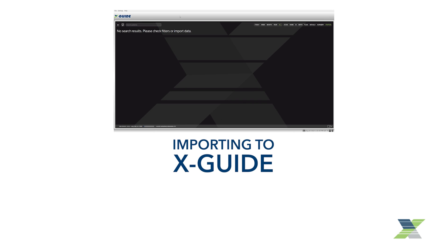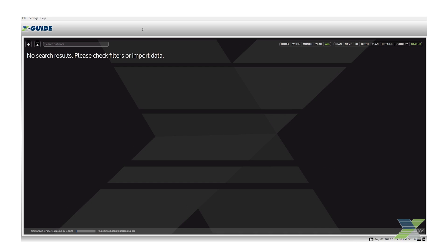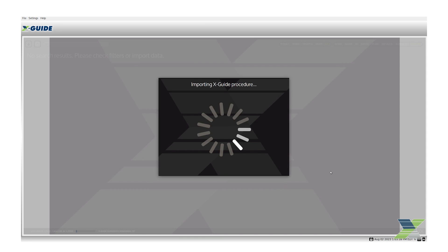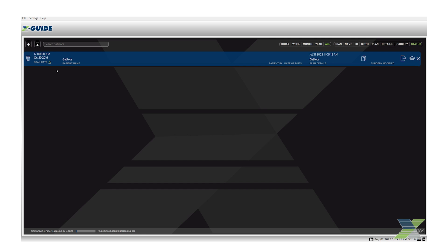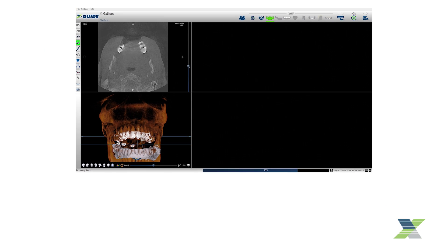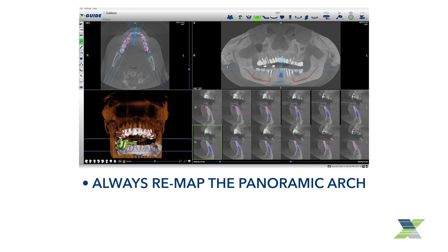To import into the XGUIDE machine, on the Patient Select landing page, click the Import an XGUIDE Plan button to browse to the location of the file. Highlight and click Open. Now that the case is in the XGUIDE software, double-click to load it. Be aware that you must always remap the panoramic arch in order to proceed.